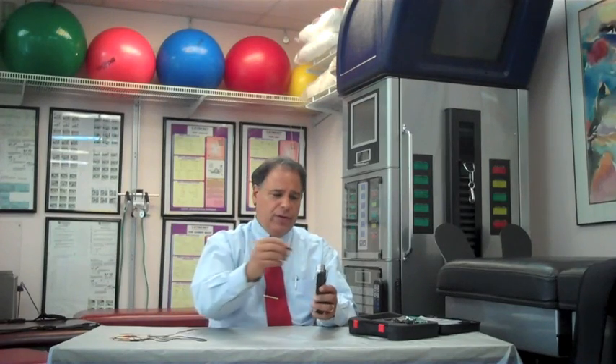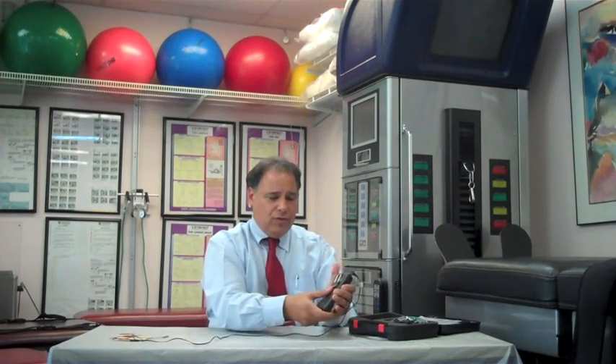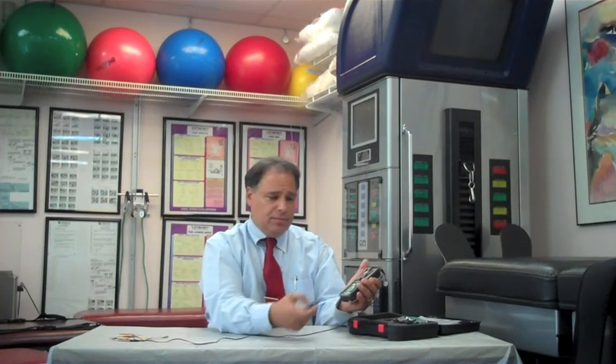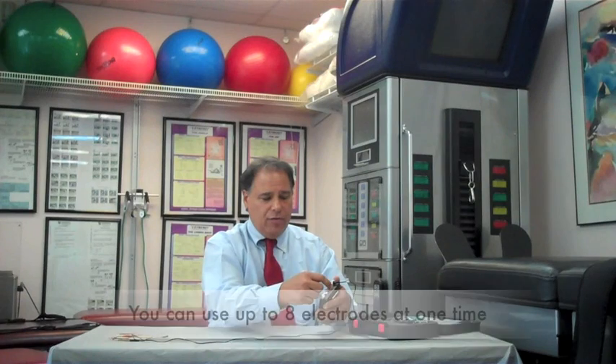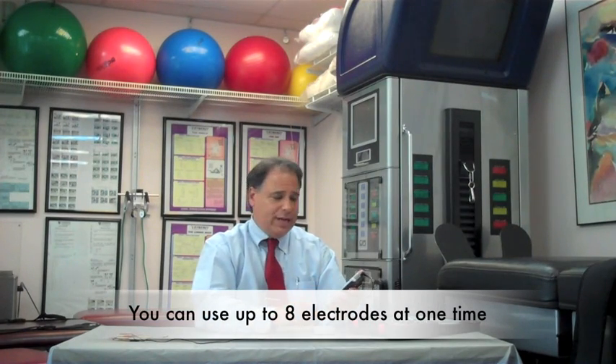To get started with this unit, you will first put your batteries in the back cover in the proper way, and then you may hook up the lead wire to the top. There are four areas where you can actually attach your lead wires.